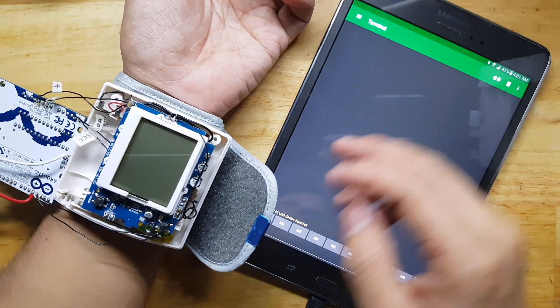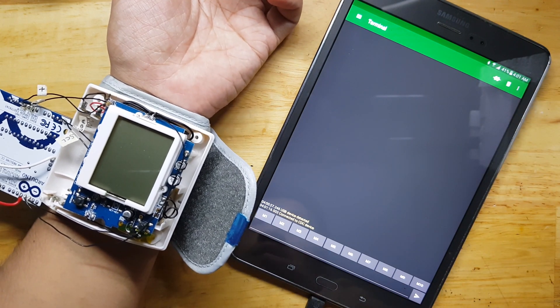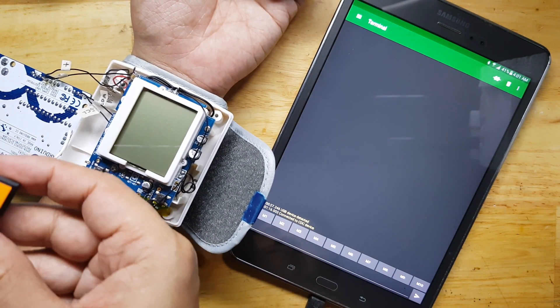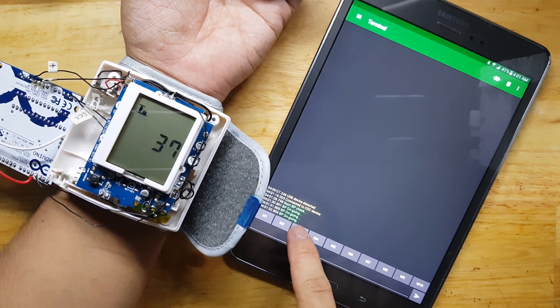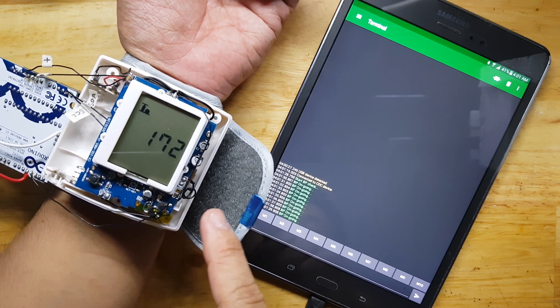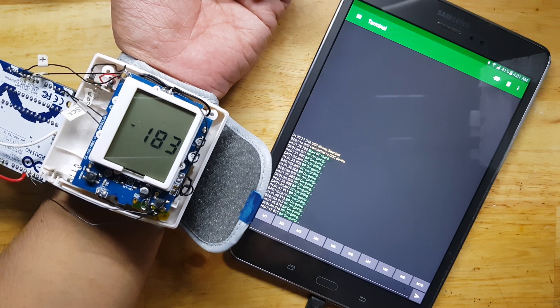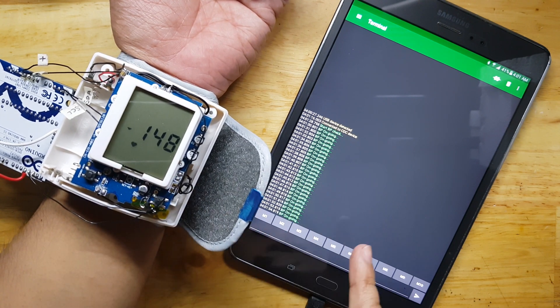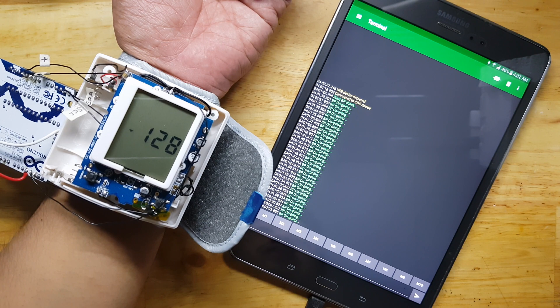Let's see what the reading would be. We press connect, and now we are connected. I have this button that will start the whole operation — I will now click it. You can see a 'Start BP check' and 'BP ongoing' message, which will appear every time the blood pressure monitor is still pumping air and trying to get the BP reading.